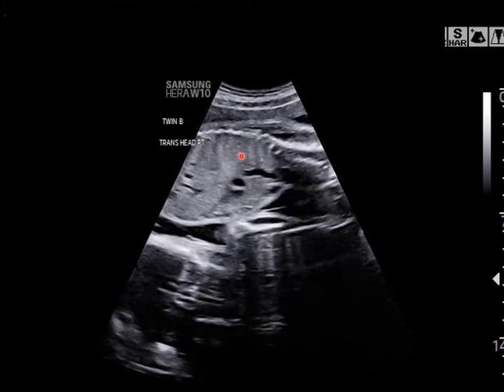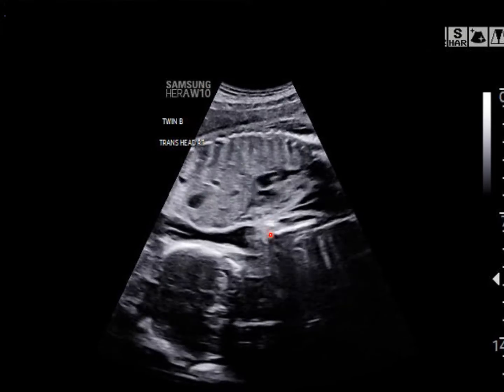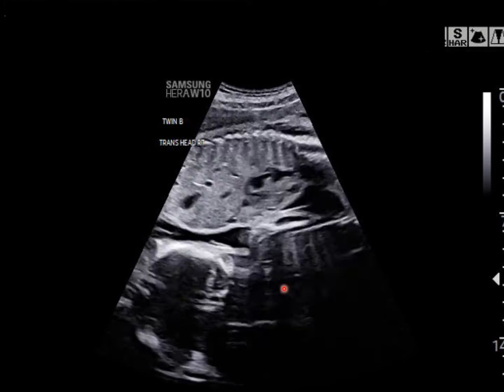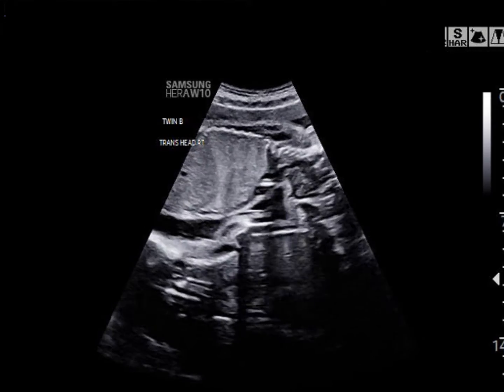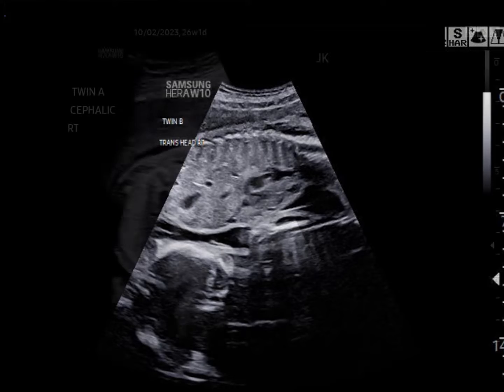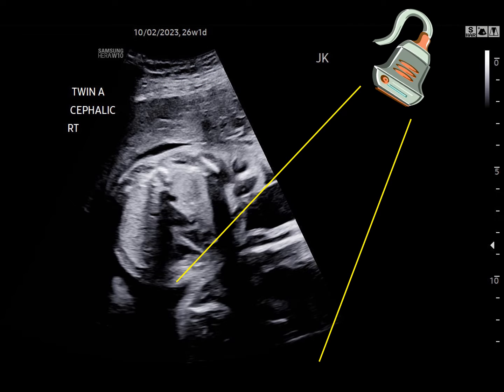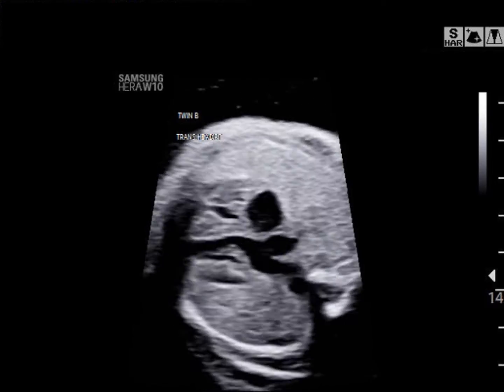However, in that sagittal view, the orthogonal view to the previous, you can see just how clear A is coming in, and then to get to B, we would have to do some maneuvering to get the images to be appropriately and clearly seen. And so from that angle that we had, we would take the transducer and translate it over, down lower and more leftward. That way we would be getting a more direct and clear image of fetus B.